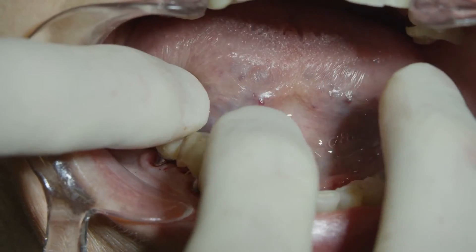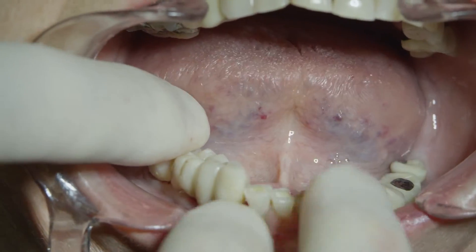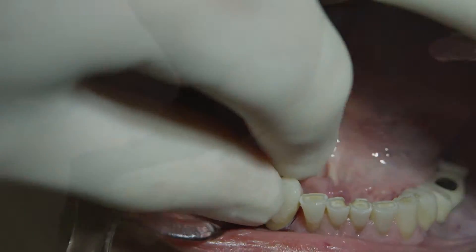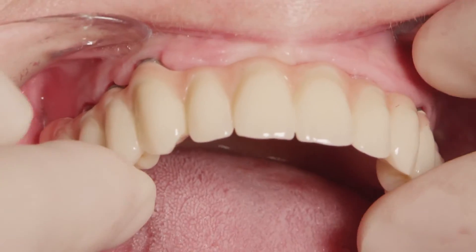You can insert the abutment directly inside the bridge, and the bridge will dictate the proper alignment of the abutments among themselves. This can be done for small bridges or full arch restorations. Remember, the Baikon system is very simple, very useful, and eliminates the need for screw connections and torque winches. Hope you have enjoyed this presentation. Thank you.